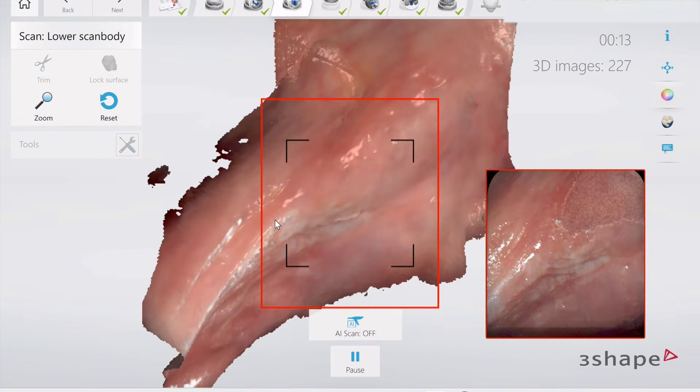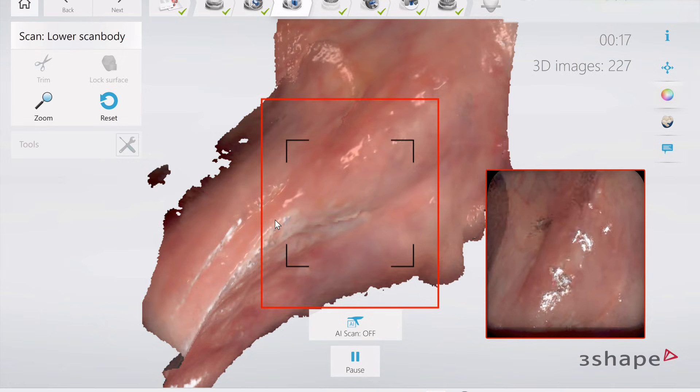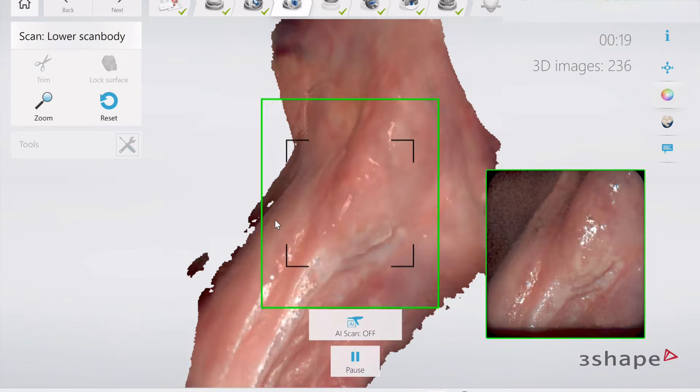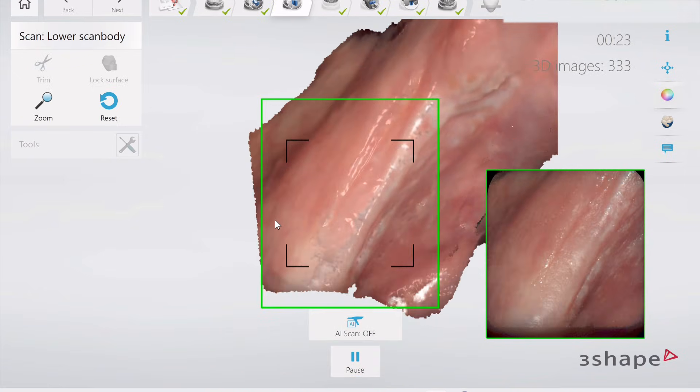Now, the way the retractors work is that these retractors are stretching the tissues and the tongue in such a way that it prevents buccal and lingual movement, which means that we can recapitulate the scan.